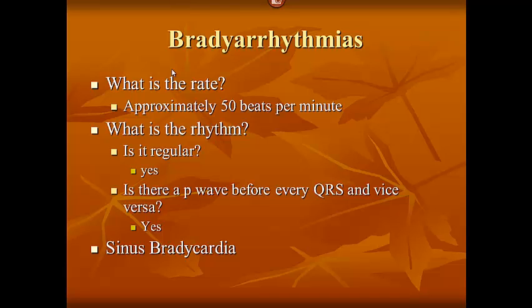occurs when an EKG under normal sinus rhythm, when there is normal upright P wave in lead 2, preceding every QRS complex, and there is a standard or the same RR interval, has a ventricular rate of less than 60 per minute.